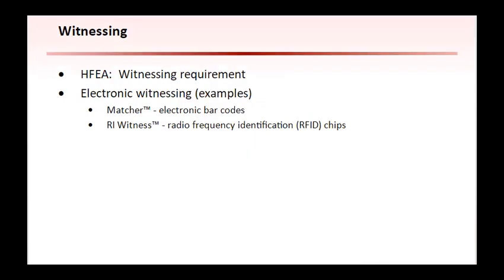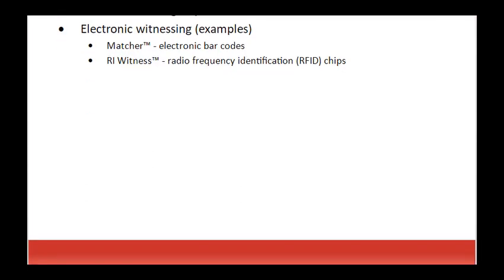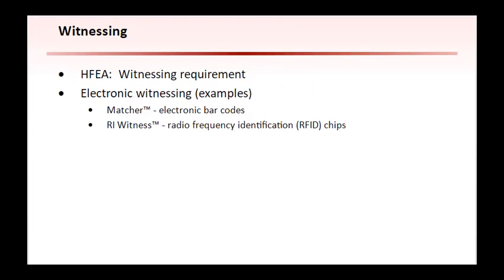Witnessing can be performed either manually or using electronic systems. In the United Kingdom, there are companies that now offer electronic witnessing. These systems match tubes, dishes, and any other materials used to treat a couple and create an alarm whenever a match is not identified.